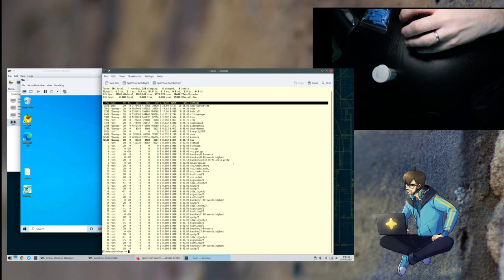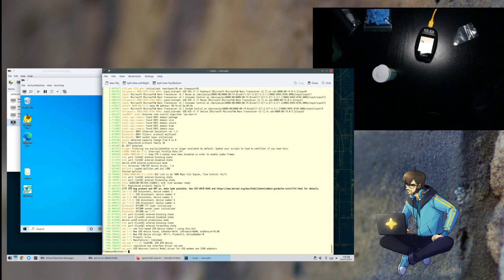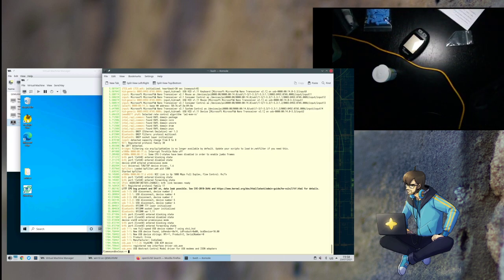So let's just see what this is. Now say it's connected to PC. Oh, it's an ACM. That's going to be fun. Not. Because this is a USB ACM device, it means that I actually have no idea how to extract the serial transfer. I never had to extract ACM data. So I don't have in my USB mon tools anything to extract ACM data. And that's going to be fun. But that's going to be the next thing. Because yes, I'm going to have more next streams. Let me see what the user manual says about where to find the software.